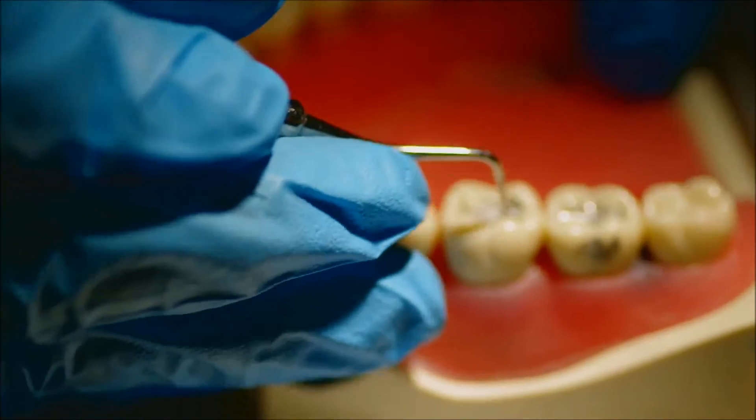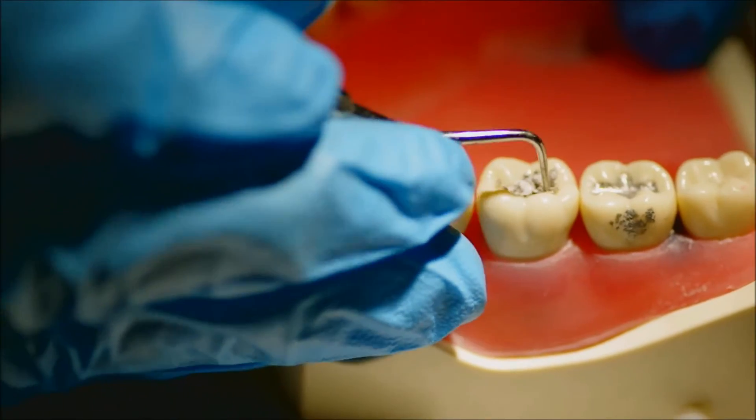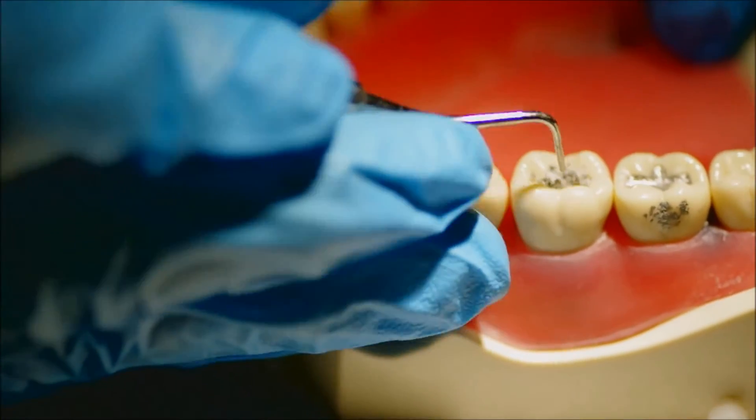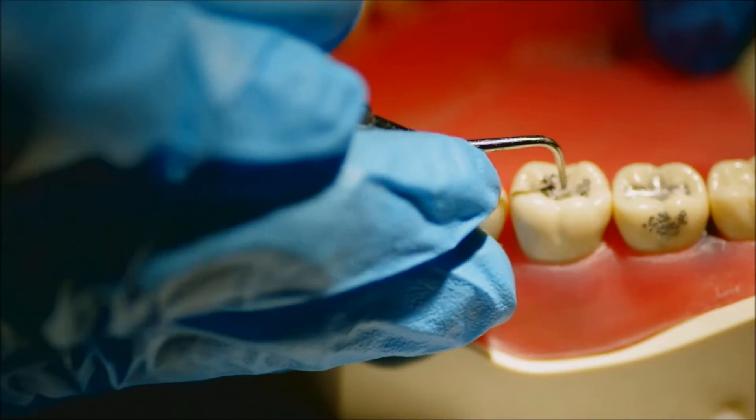In order to do the amalgam restoration for a class 1, you're going to take your amalgam pellet to the amalgamator for 10 seconds and gather the amalgam in the well.